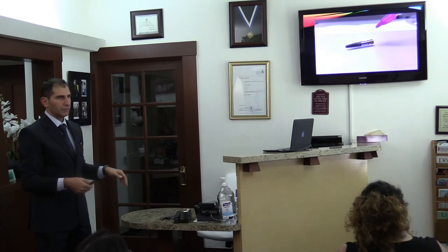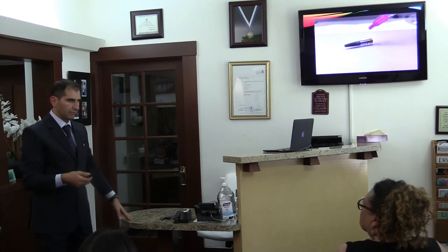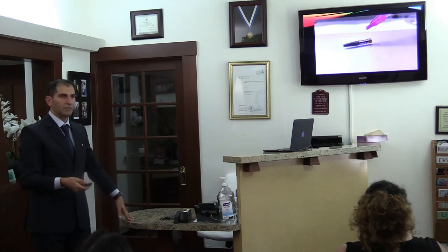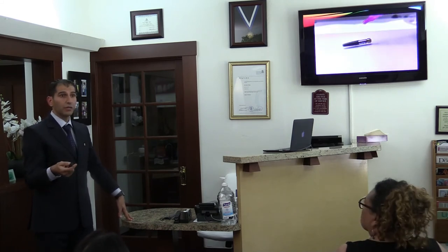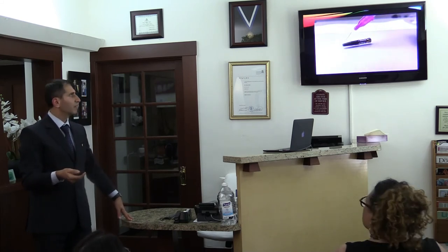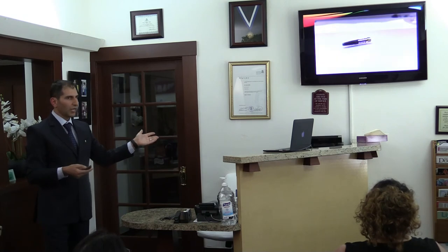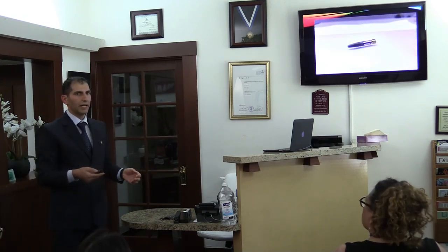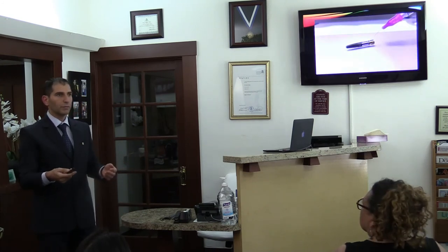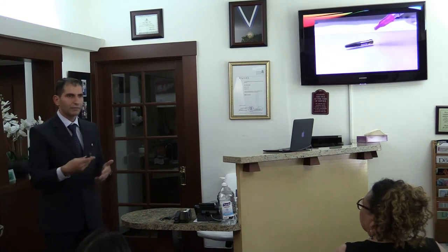Now you can see the difference. And I'm sure you guys have heard about the Straumann SLActive type of surface. It's called hydrophilic, and you can get faster healing. But we don't have anything on the abutment. So how can we utilize the abutment and make it hydrophilic? But you can see the difference. So anyway, I think I called like 20 companies. Only one company was willing to work with me, because they work in big industry in Silicon Valley, and, who are you, a dentist, to have them do something for you?